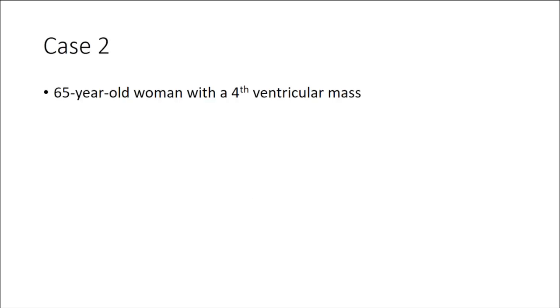Moving to the next case, we have a 65-year-old woman with a fourth ventricular mass.